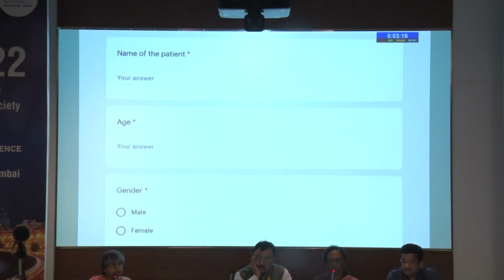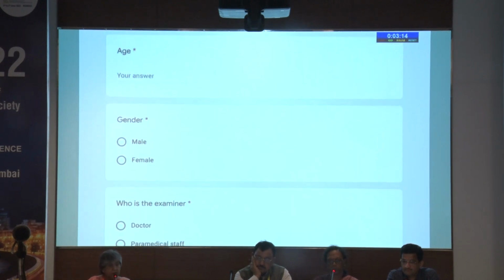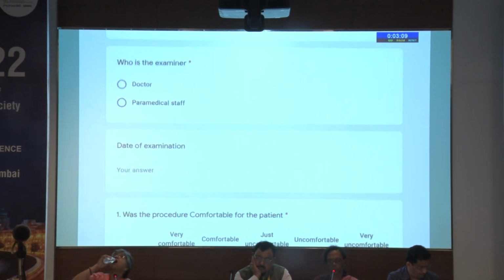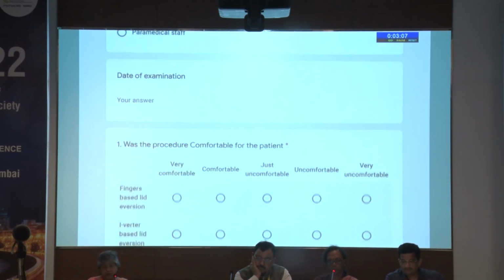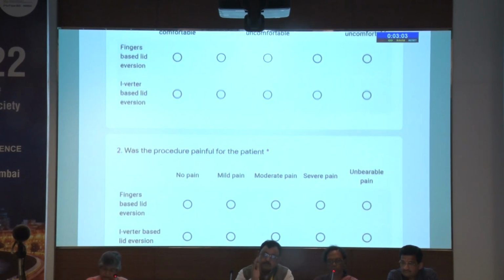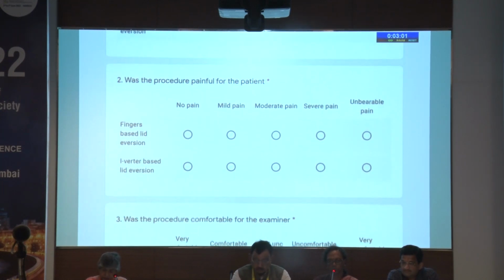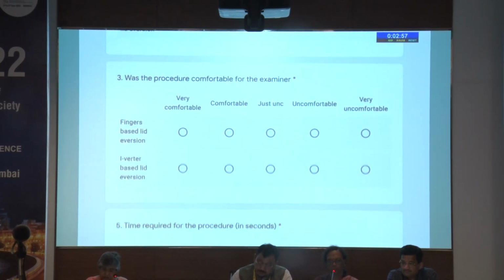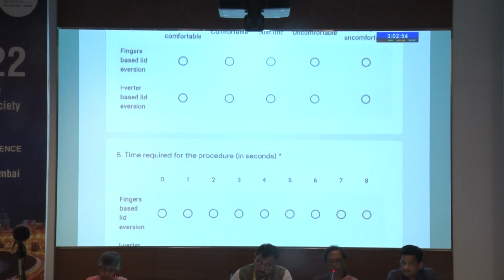The name of the patient was registered along with the age, the gender, who is examining, doctor or paramedical staff, and the date. We asked the patients how comfortable it was, from very comfortable to very uncomfortable according to the visual analog scale. Then, was the procedure painful, from no pain to unbearable pain? Was the procedure comfortable for the examiner, very comfortable to very uncomfortable?